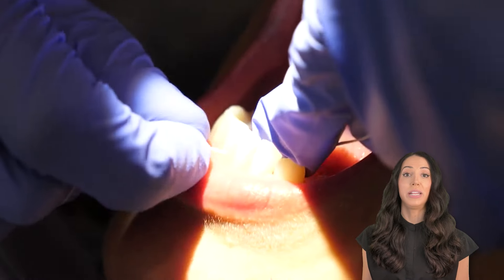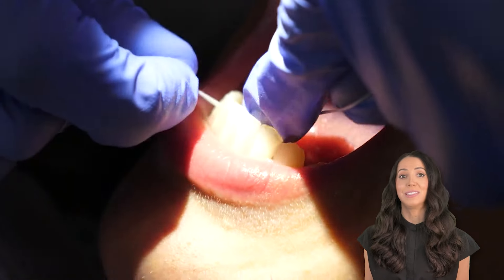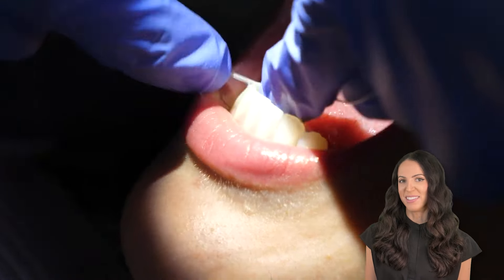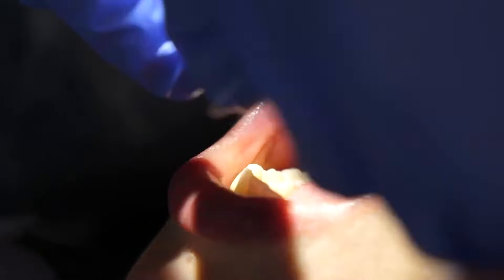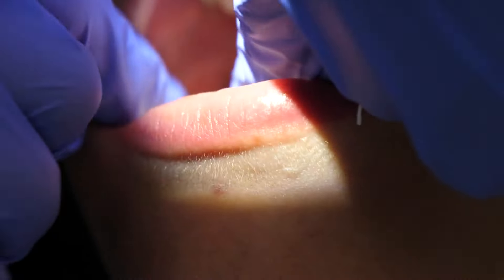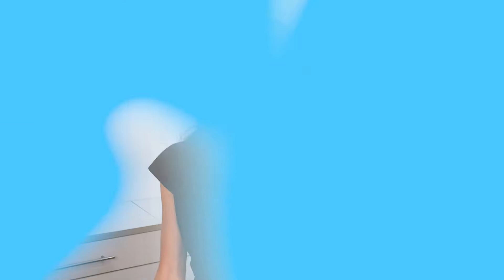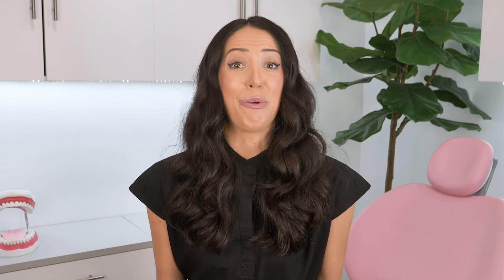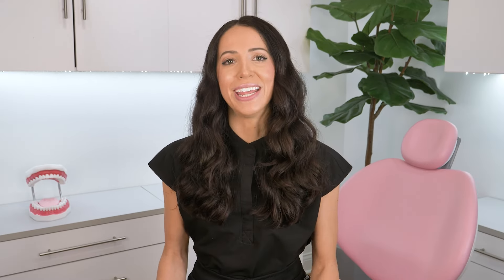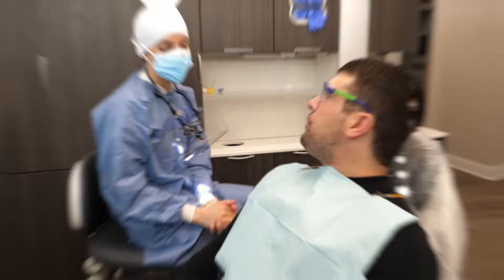Lastly, after you finish the whole mouth doing the surface-by-surface sequence, or whatever your favorite sequence is, I like to double check everything. Here you can see me running the scaler along the gum line to make sure I didn't miss anything — and if I did, I can get it now. Then here I am showing the flossing, which is another great way to check for any missed pieces of calculus. The floss sometimes gets stuck on it — you'll feel it.